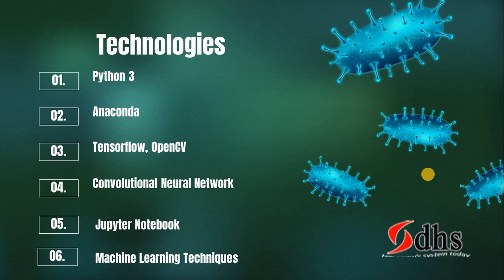The technologies used: Python 3, Anaconda, TensorFlow, and OpenCV, convolutional neural network, definitely the parent algorithm of all the existing algorithms, and then Jupyter Notebook, our IDE, and some machine learning techniques we use for pre-processing.